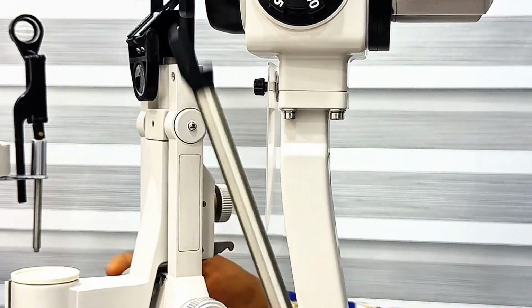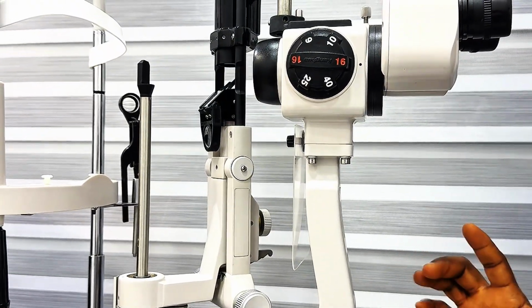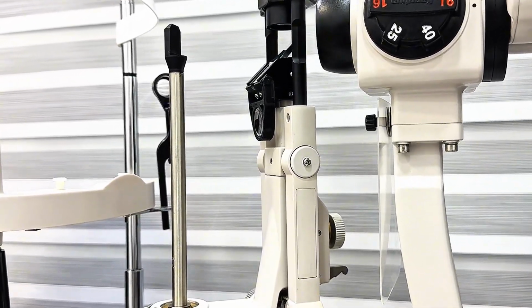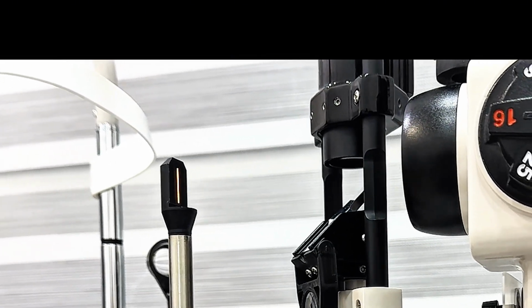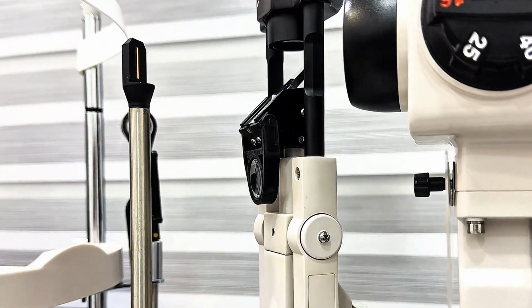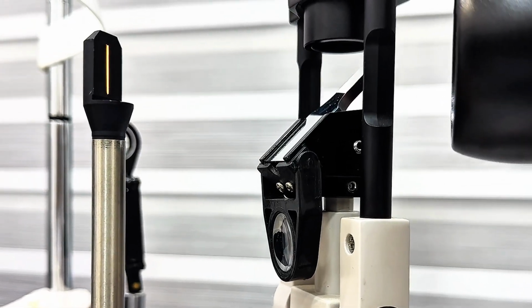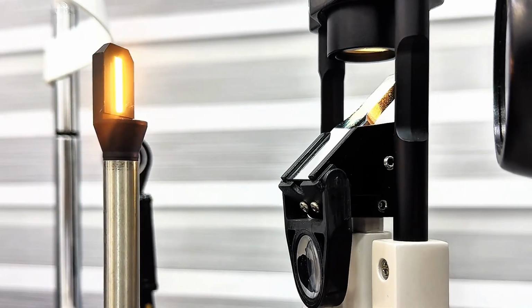So this is my focusing rod. I'll be inserting it here. Then I go ahead to reduce my rheostat to the barest minimum and turn on my slit lamp. When I turn it on, I can increase the brightness of my illumination until the first light just shows. Once this first light shows, this is the width you should use for your optic section or for your Von Herick technique. You can see that it's getting wide.